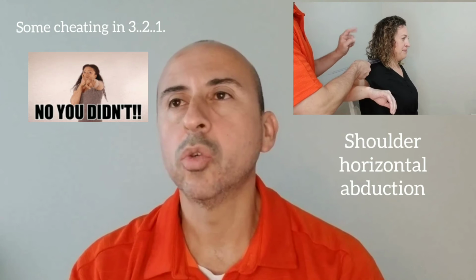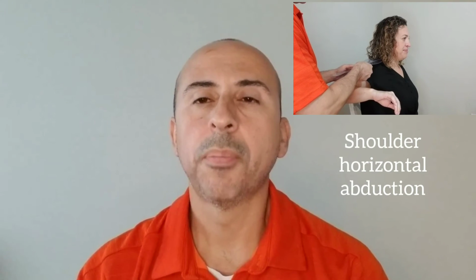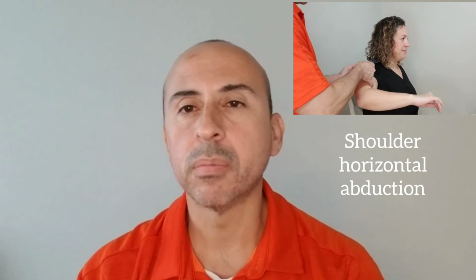The other thing I see students sometimes do is just the positioning of the client and of themselves. Remember, you want to be in a comfortable position. You want to be sitting down on a stool if it can be possible. If you have this client standing up, then that's fine too. But depending on the setting you're in, that may or may not be as easy to do with all your clients. But again, ultimately, you want to position them in a way that's comfortable for them, that prevents them from cheating, and that allows you to have your hands free to use a goniometer and position or stabilize them as needed. And sometimes I see students making that error, and even some licensed therapists as well.